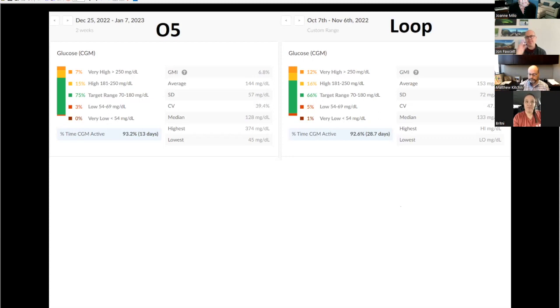So your blood sugar is going up and down. The target, like Matthew said, isn't really relevant. It's the result of that target. So take a look at your A1C, your time in range, standard deviation, and a 110 can get you into the low 5s for A1C, into the 90s for time in range, and I've seen people in the 20s and less for standard deviation.